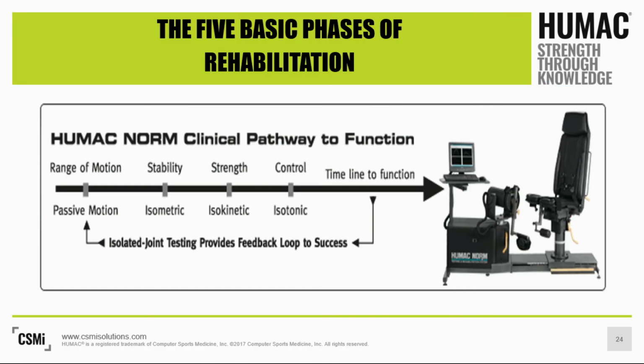Now that we've learned the concepts behind isokinetics, let's now go into how you can use it with your patients throughout the entire plan of care.